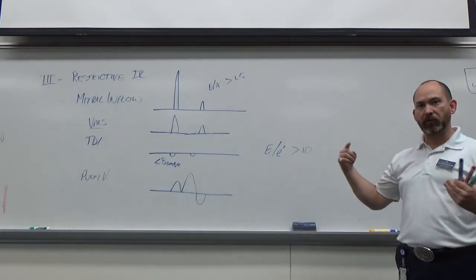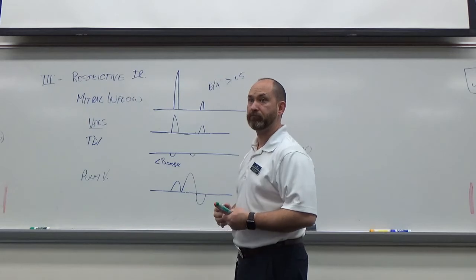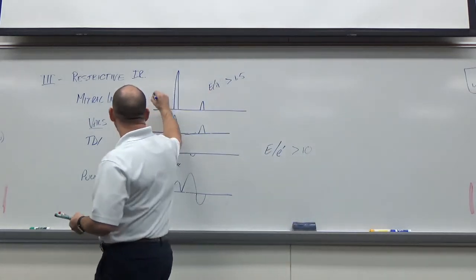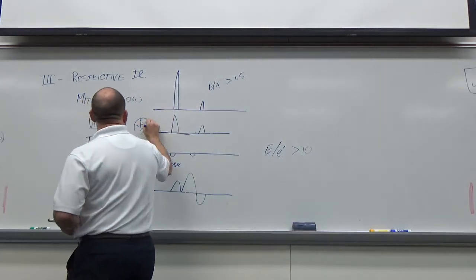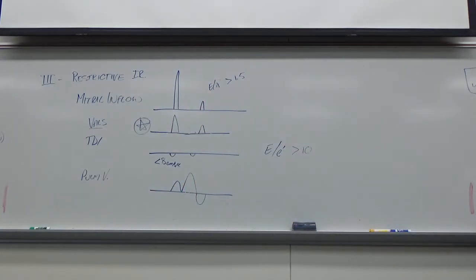So really, what's the differentiation between this irreversible and reversible? Valsalva stays the same. It's really Valsalva. Okay? So if I don't have other pieces of information that are going to significantly change my diagnosis, doing a proper Valsalva here is going to be important. Okay? All right. What's the propagation velocity for this one? It's again less than 45. So that doesn't change.